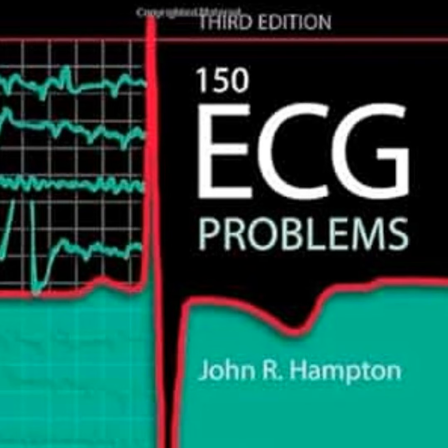Right. But what is the actual physical mechanism driving that massive voltage on the paper if the heart muscle isn't actually hypertrophied? Well, it really just comes down to basic physics. It's all about the proximity of the recording electrodes to the actual myocardium. Oh, okay. Yeah. So in a young, thin individual, there is very little adipose tissue or even muscle mass between the heart itself and the chest wall where the leads are placed.